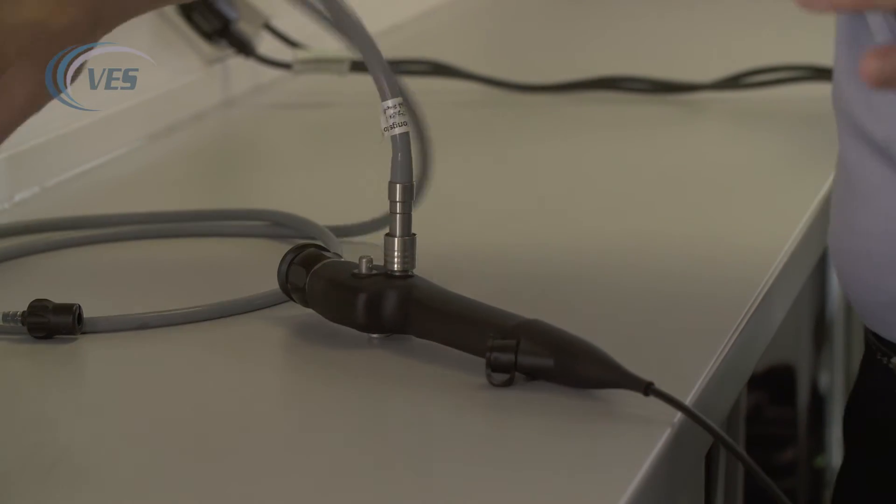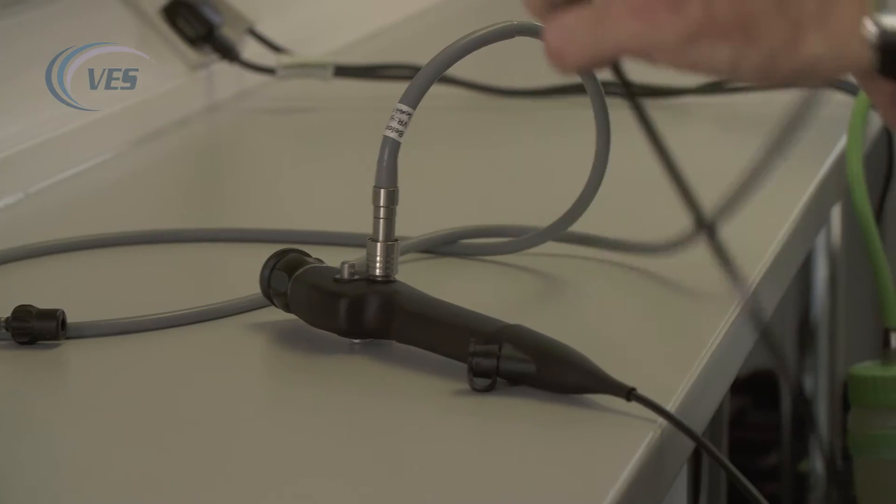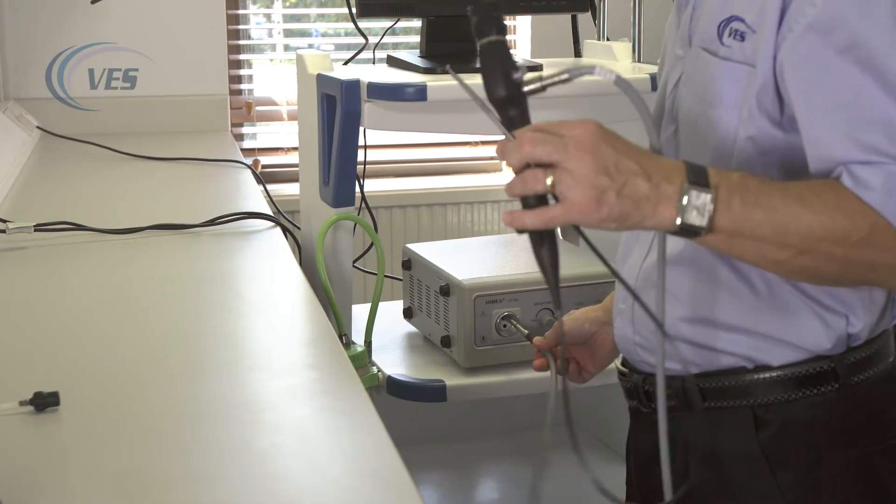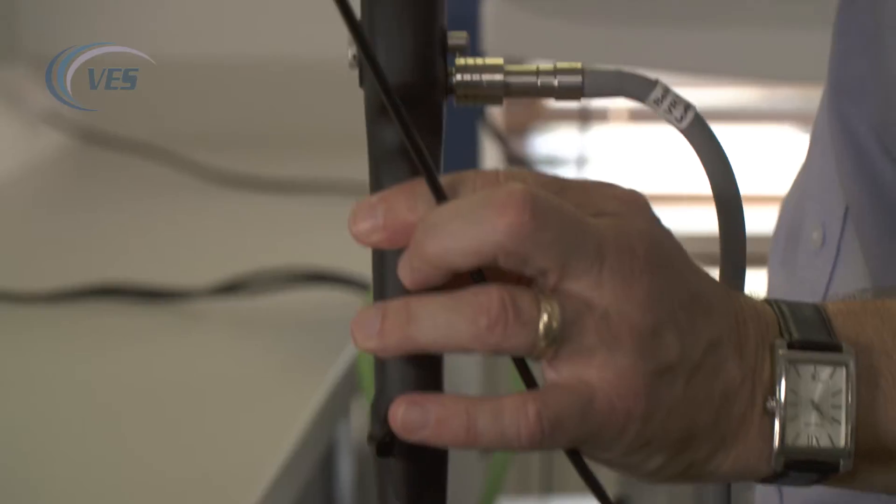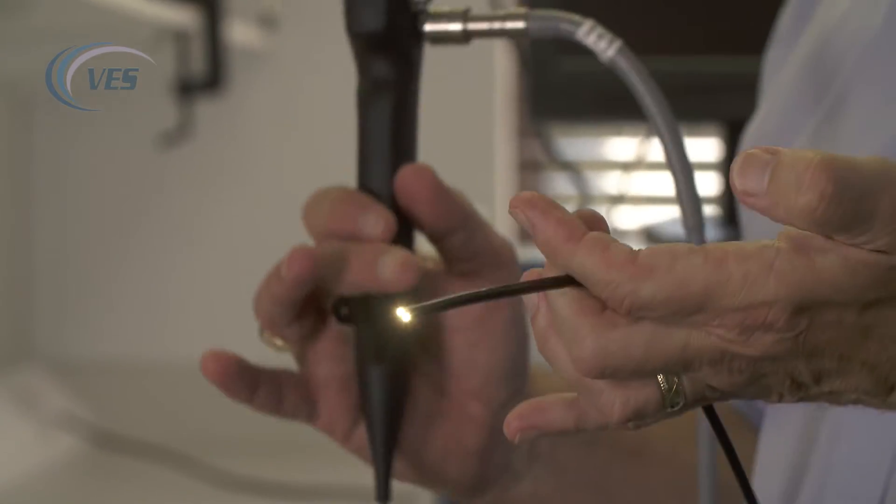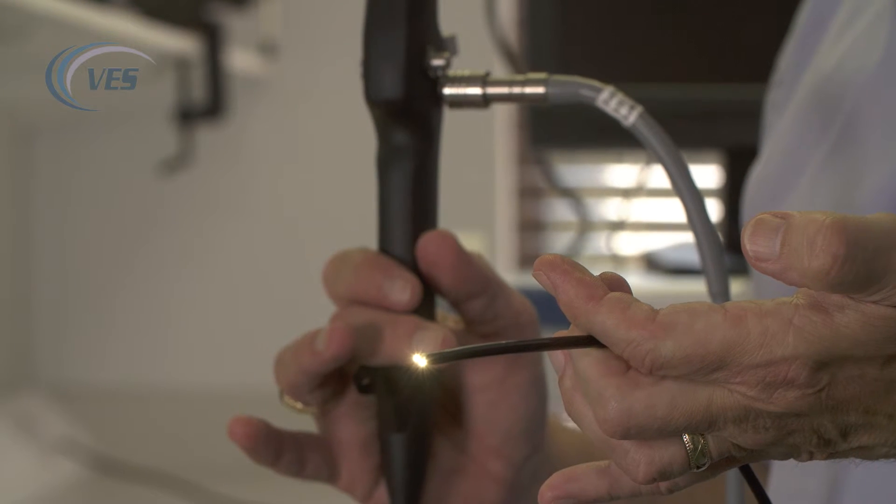And that goes into your light box. Turn your power on, and there you have the light coming through the end of the scope.